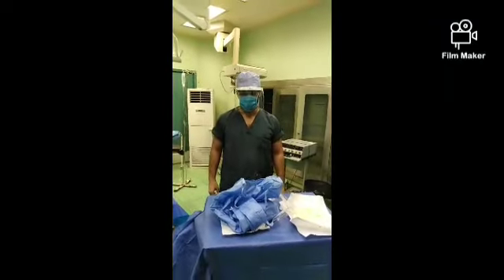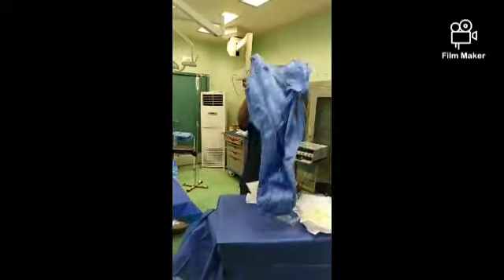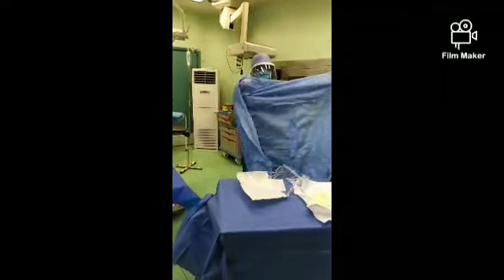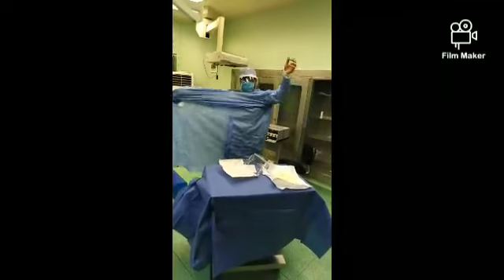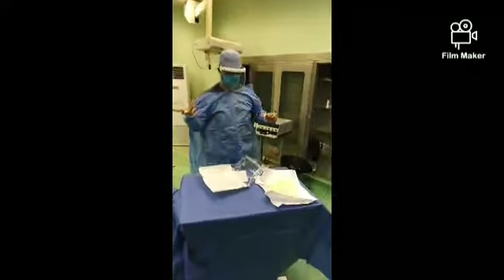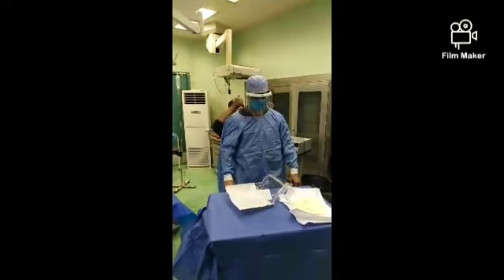Now Dr. Mohamed will show us how to wear the sterile gown. He catches his sterile gown from the inner side without touching the outer side. He gets inside the gown without readjustment, and he keeps his hands up. That's his position. An assistant comes to tie the back of the gown.